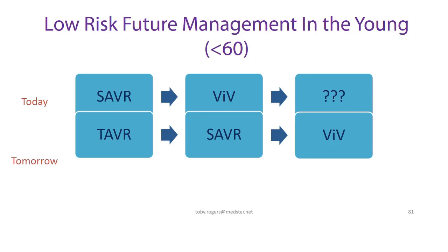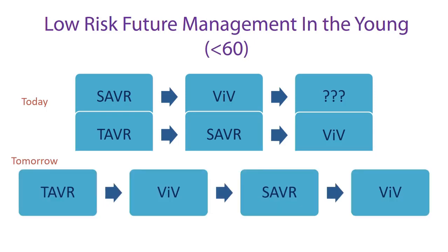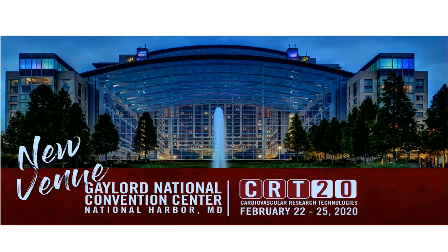Although, what I would tell you is that in most institutions, the age threshold has dropped to the mid-60s now, and in some, the early 60s, for a bioprosthetic valve. And if that's the case, then we may advocate that TAVR would be better than SAVR because you get better hemodynamics, so it's something to consider. So TAVR, valve-in-valve, SAVR, valve-in-valve: a lot of things to think about. But one thing is for sure: the technology has matured.